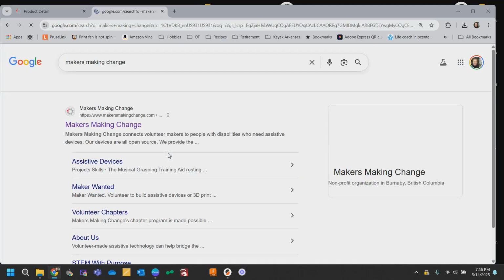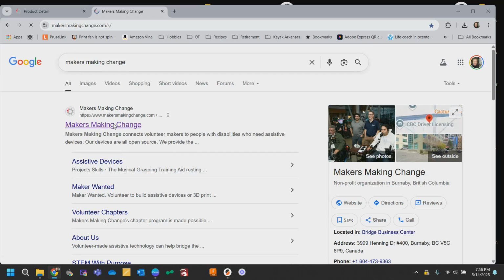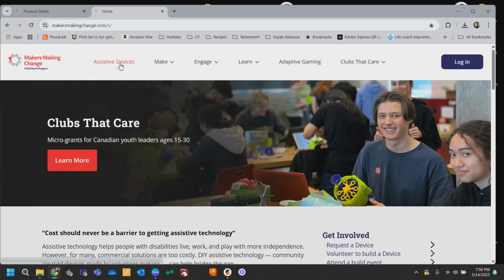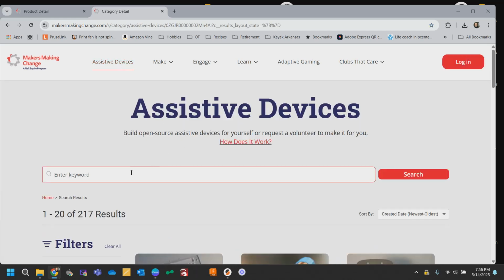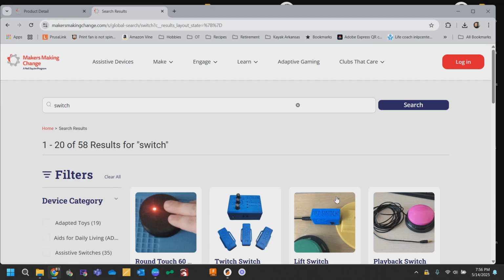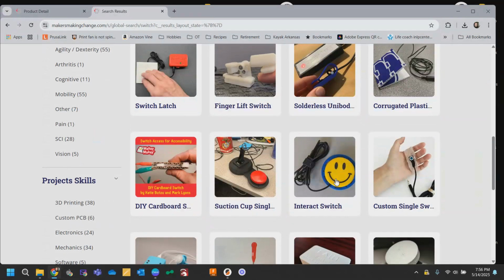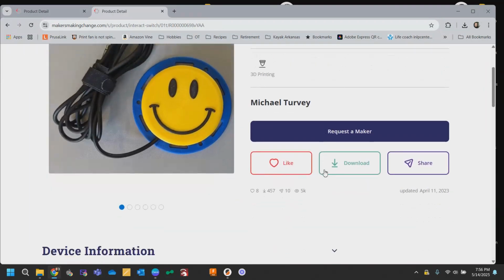I'm going to choose Makers Making Change because they focus on assistive devices. They'll show you the build files for 3D printed assistive devices as well as other ways of making assistive devices. Let's search for something we're interested in. I'm going to search for switch. I think switches are one of the most helpful things to 3D print in your practice. This Interact switch is very good, very light touch, and very sturdy.